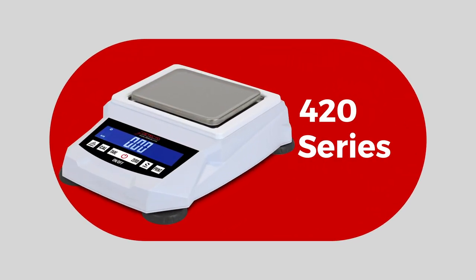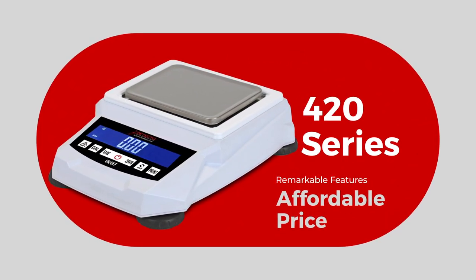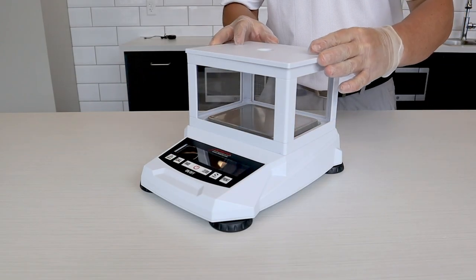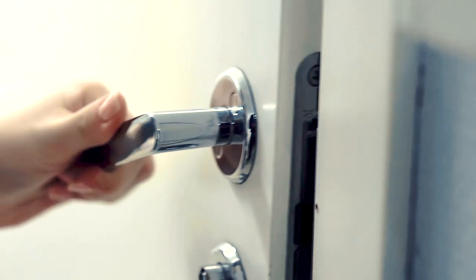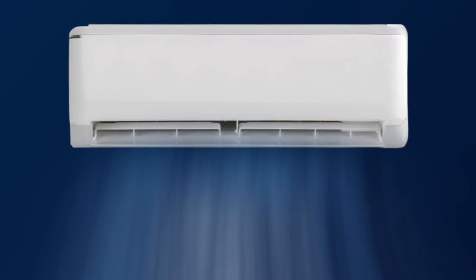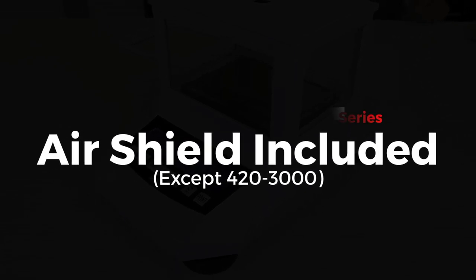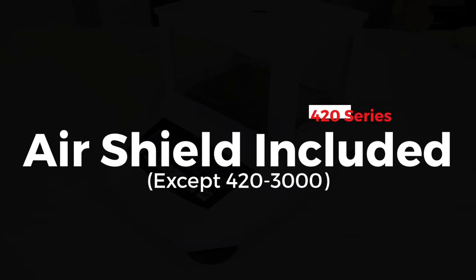The 420 series offers a combination of remarkable features at an affordable price. Most models come with an air shield for finer weighing applications when the scale is located nearby a doorway or air duct that could affect weighing. The air shield is included with all models except the larger platform size 423000.